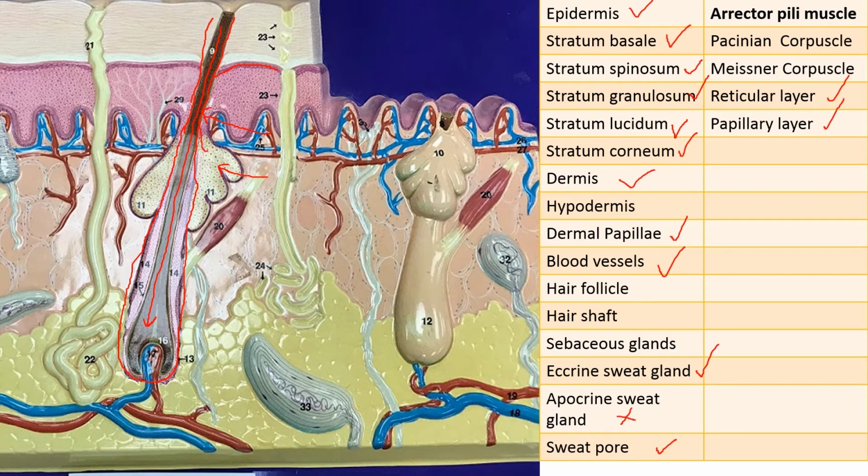It follows the hair follicle up to the surface of the skin where it comes out, and it also helps to lubricate the skin. So that was the hair follicle. The brown part was the hair shaft, and then you have the sebaceous gland, this kind of blobby looking gland attached to the follicle. Okay, located there as well.